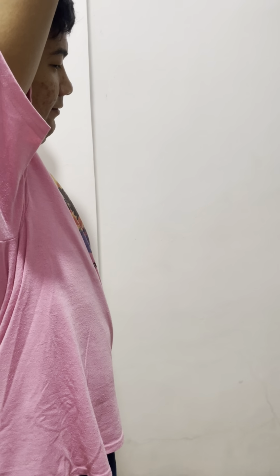Yan po. Next projection for glenoid cavity, AP oblique projection Grashe method is to show joint spaces between humeral head and glenoid cavity. Next projection for glenoid cavity is AP oblique projection Apple method. Patient po natin ay weight bearing. It is to show the scapulohumeral joint.